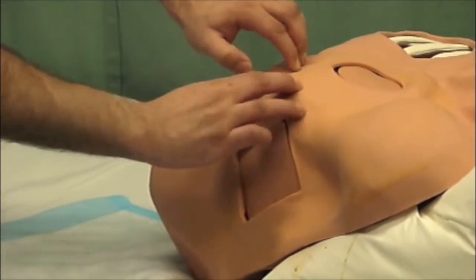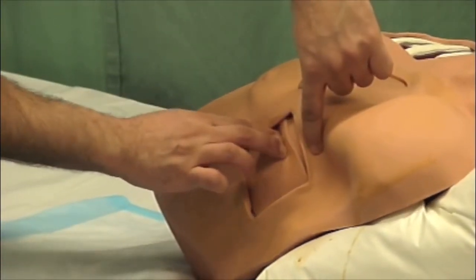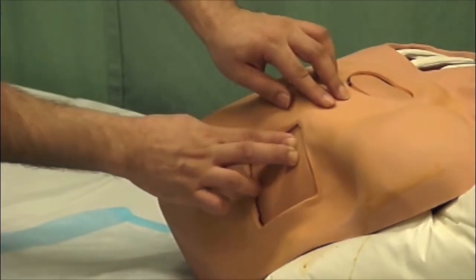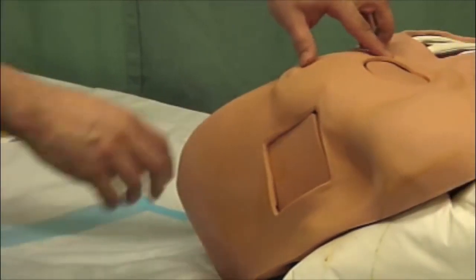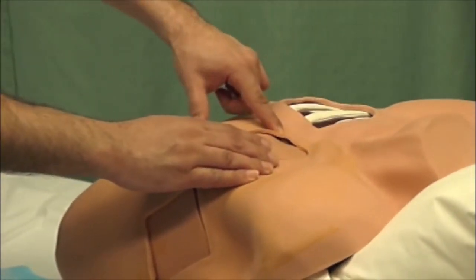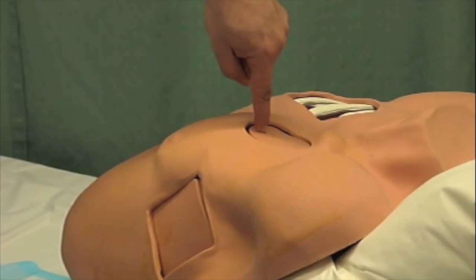The first is at the fourth or fifth intercostal space between the mid and anterior axillary lines. Care should be taken to avoid insertion through breast tissue. If necessary, retract breast tissue with tape. The alternative insertion site is the second intercostal space at the mid-clavicular line.